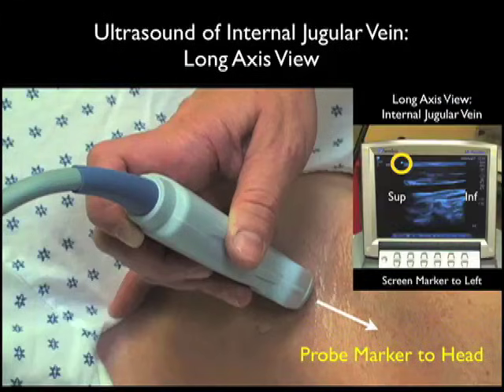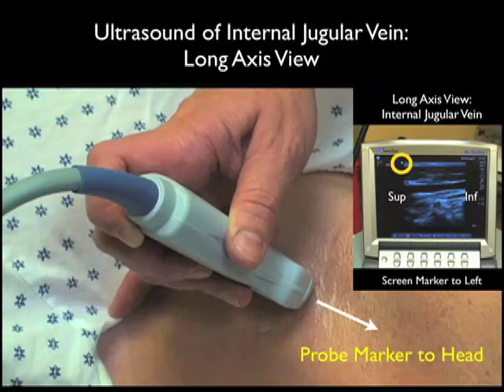Therefore I know where it lines up on the ultrasound screen. Notice here that, as the screen indicator dot is towards the left, superior on the internal jugular vein will be located towards the left of the screen, and inferior will be located towards the right of the screen.